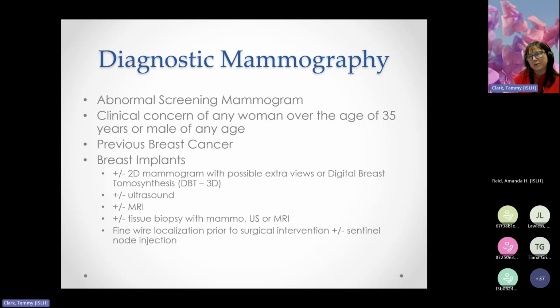All right, so moving on to diagnostic mammography. So we get all our women into the screening program. Participation rate is going up. That is the one thing I want to let people know for screening mammography. It was hovering around 50% for years. It is moving up, and that's why we have wait lists. We've actually expanded our screening hours down here in Victoria till 11 p.m. every night, Monday through Friday. So we are getting more people in. So we are getting the word out there. So just keep promoting screening mammography.